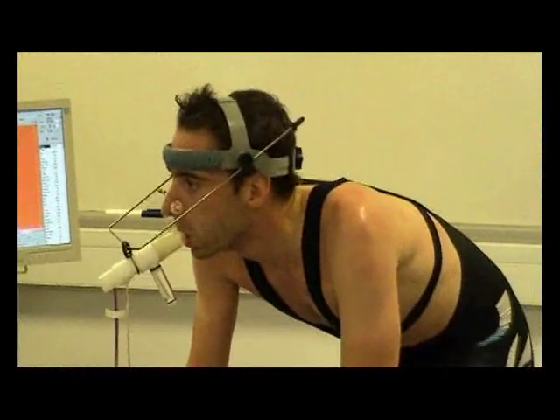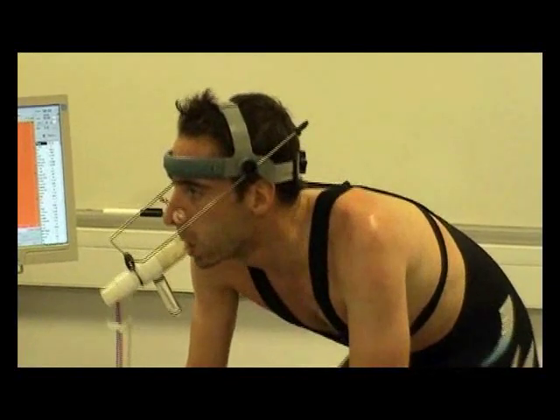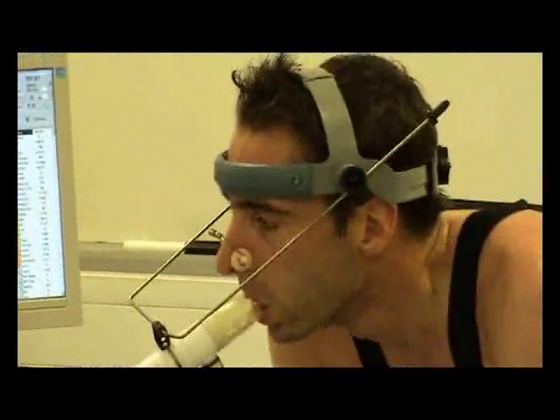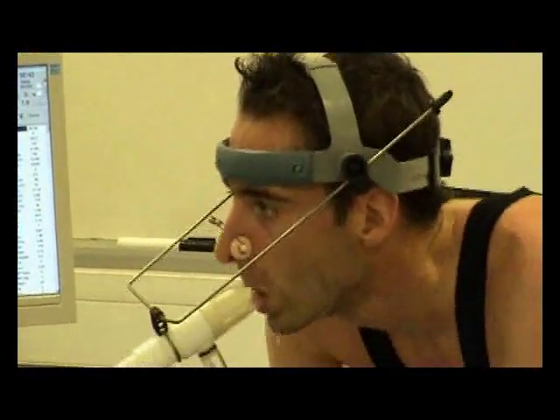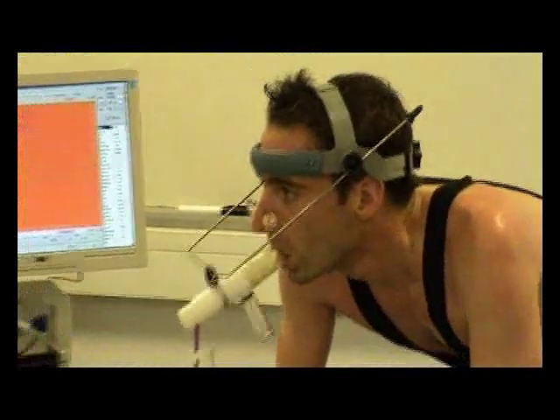We're coming into the last minute of the test now, and you can visibly see how hard the athlete is having to work. The breathing rate is really increased, and you can see the body movement increasing too. This is fantastic — come on, keep pushing.